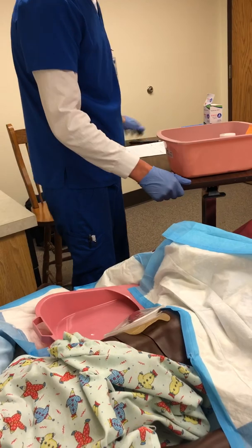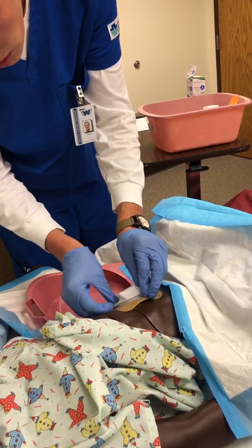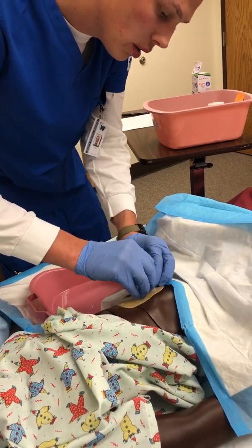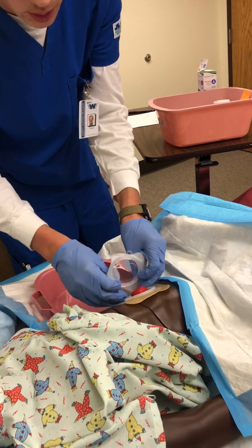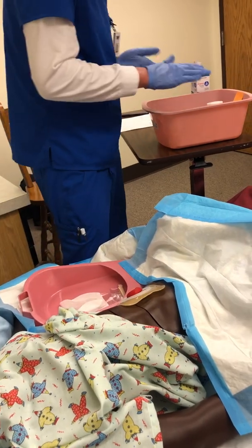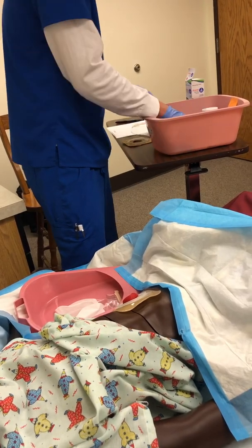And so my first thing is going to be to remove the patient's old ostomy bag, slowly peeling back and making sure all the contents stay in the bag and into the bedpan. Make sure my things are all laid out here.